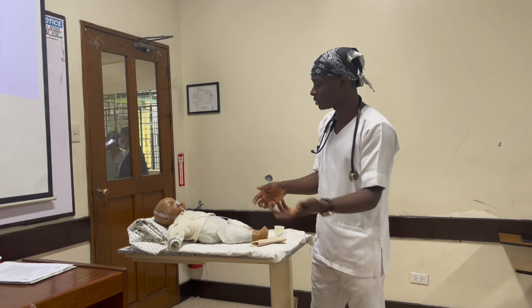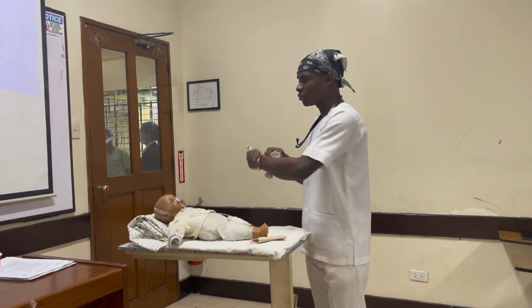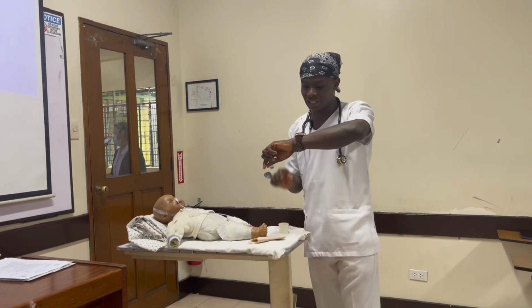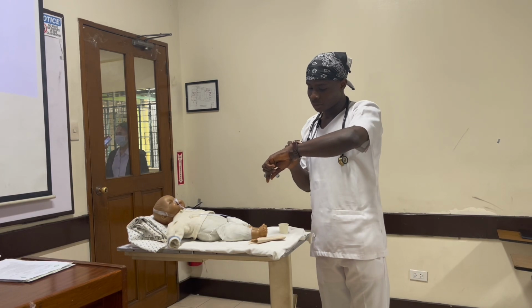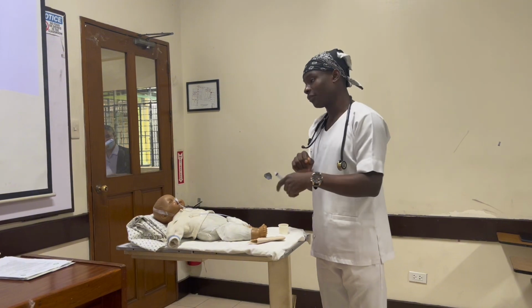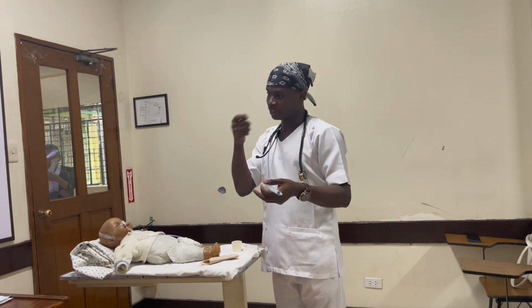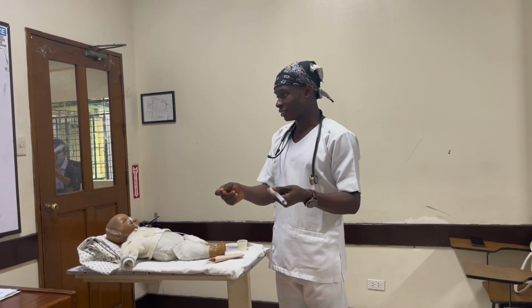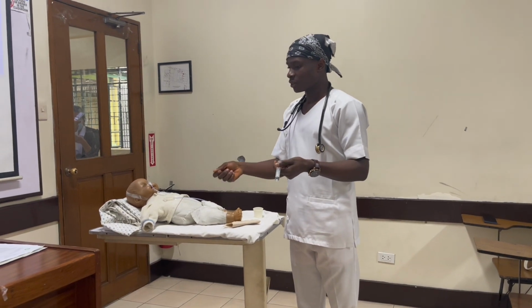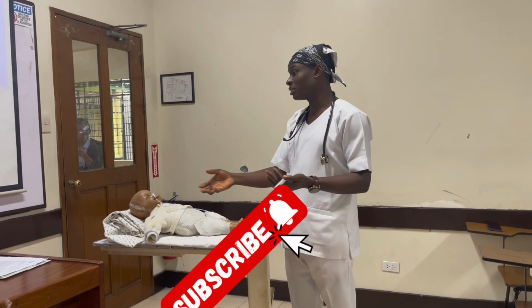So afterwards, what is next? The next is to clean up, then dispose of this, remove my gloves, and perform my hand hygiene. Afterwards, what should I document? I document that at 3:50 a.m. I gave feeding, feeding without obstruction, to the baby, with his or her name. Then after that, I document the reaction of the baby.